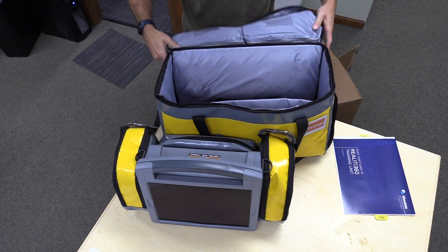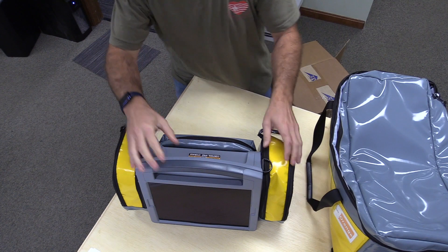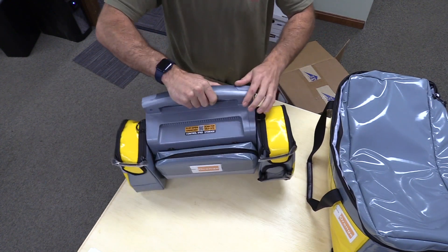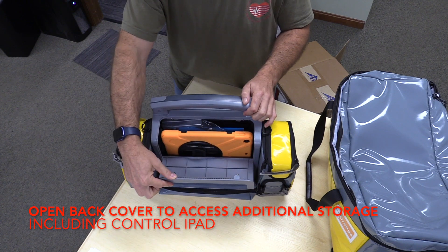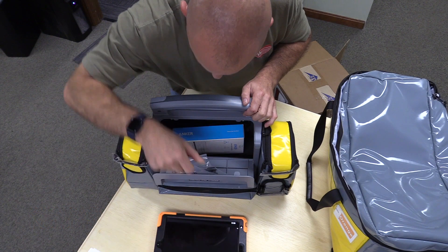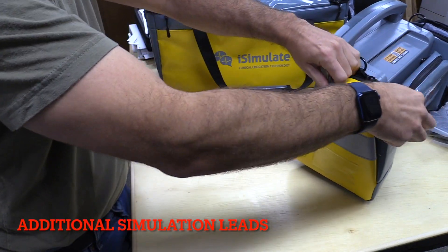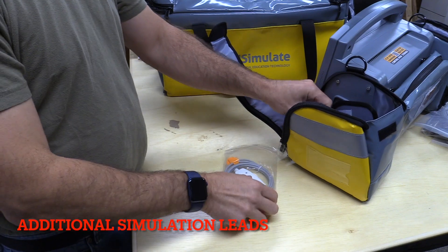As we take the monitor out, we can set the carry case aside for the moment. Inside that case is already mounted your 12.9 inch iPad. The back cover opens with the flap to access additional storage, including your control iPad, a battery backup, and some additional wires and leads. On the side cases, there are additional simulation leads which we'll install later.